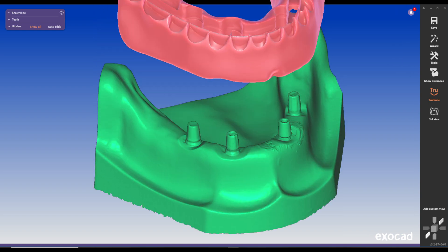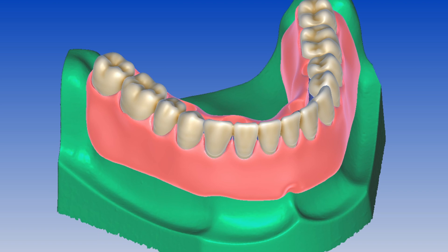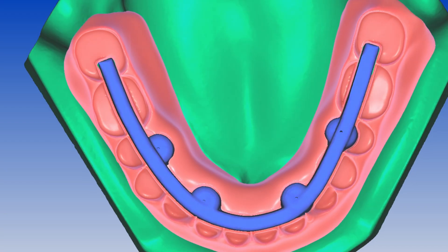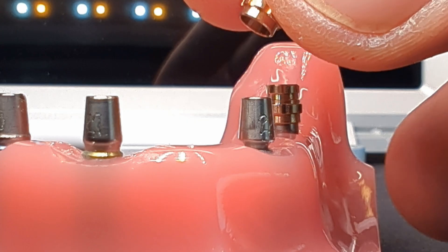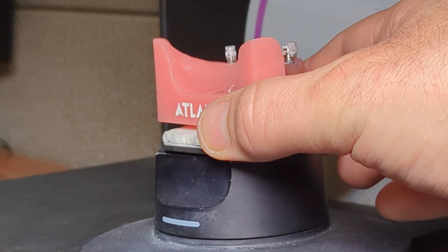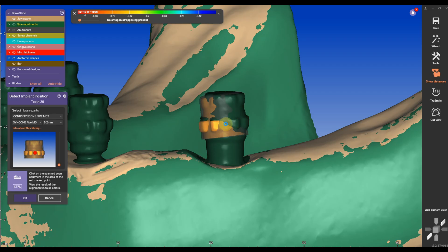This is the most underrated digital removable all-on-four option on the market, including a printed denture base and closed titanium bar and milled denture teeth, all on friction-fit Conus abutments from Atlantis. I will show you the entire digital workflow from designing the denture to the bar with a special library I created, and many tips and tricks you can use in other digital workflows.